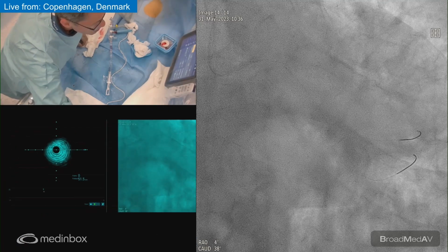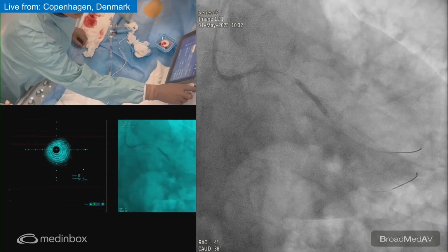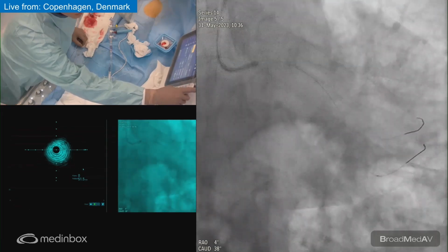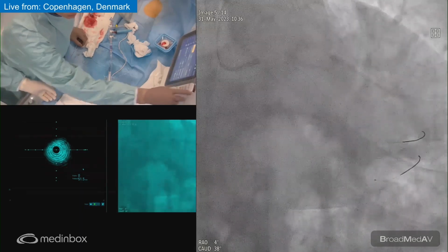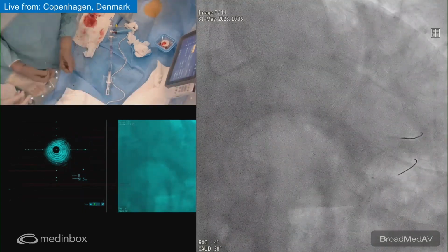This is just ordinary issues here. We need to do a rerun. It has been done, so now we're ready.